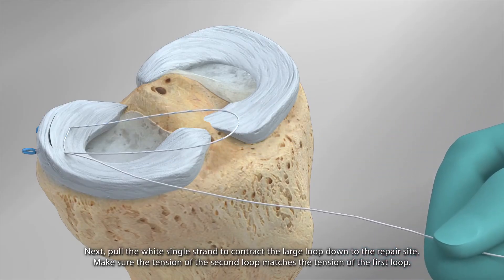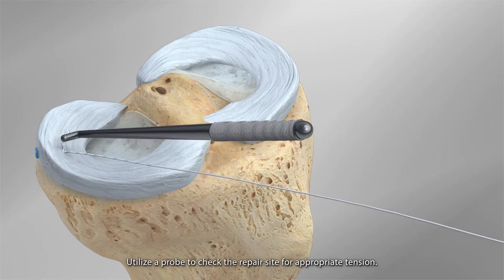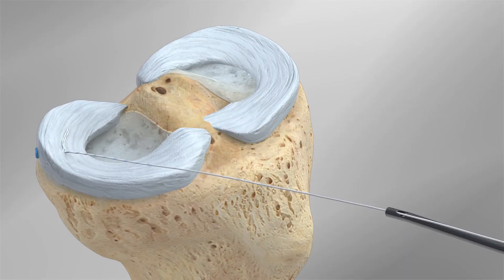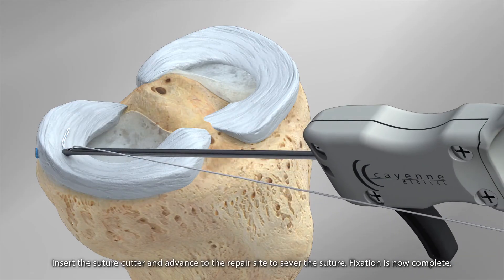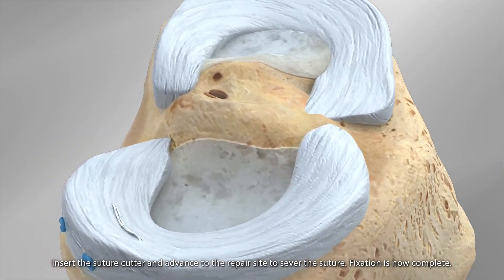Make sure the tension of the second loop matches the tension of the first loop. Utilize a probe to check the repair site for appropriate tension. Insert the suture cutter and advance to the repair site to sever the suture. Fixation is now complete.